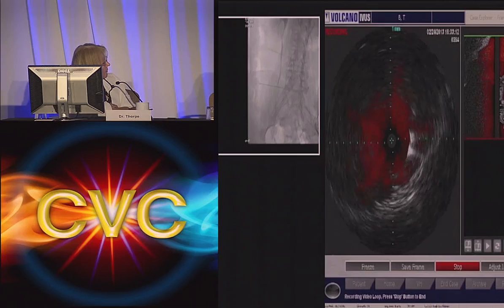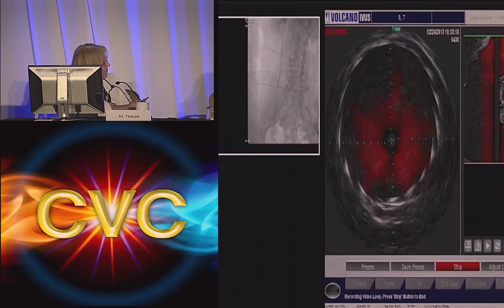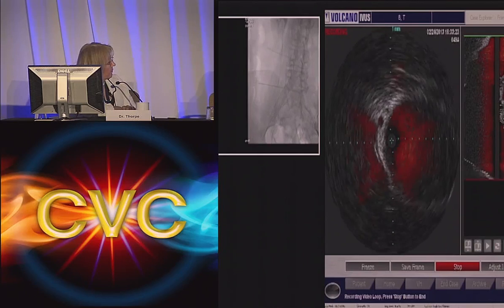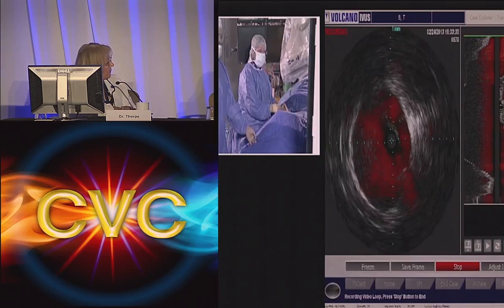There's a bit of an area where the vessel is actually wider in one dimension than the stent, but the flow will go through there. There won't be any problem with any thrombosis or anything, and the hypogastric will empty nicely into there. And there we're back into the normal vein. And those little web effects down there distally.